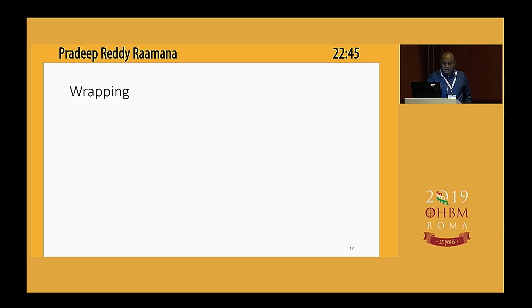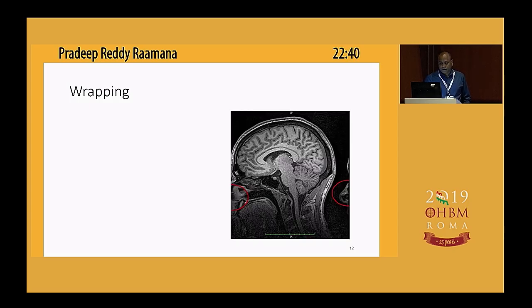So the first of the artifacts in this modality is something called wrapping. For example, something that looks like this. I think the screen is pretty good to see all the colors, right? Even from the back. So there is a little red circle. Even, in fact, it's funny that even the circle is wrapped. So you can see the nose that's wrapped around the edge.